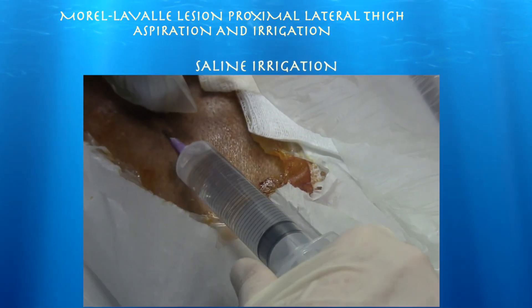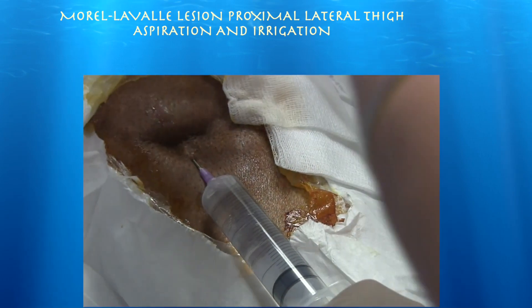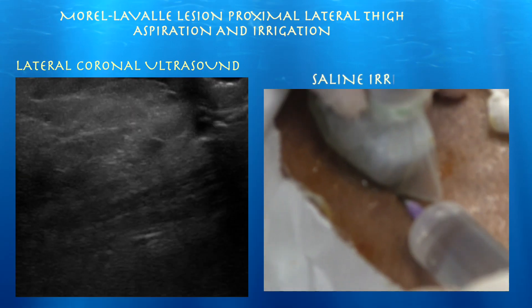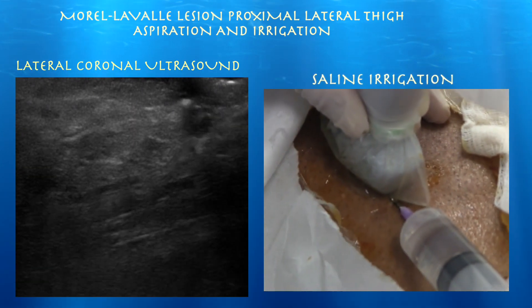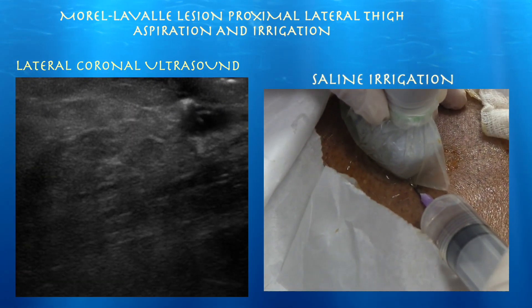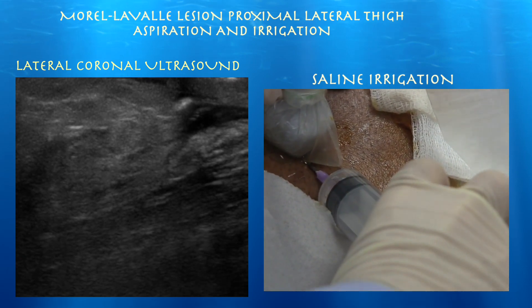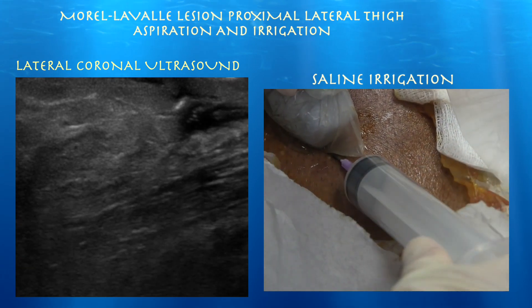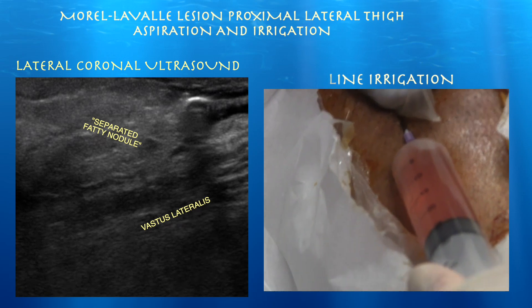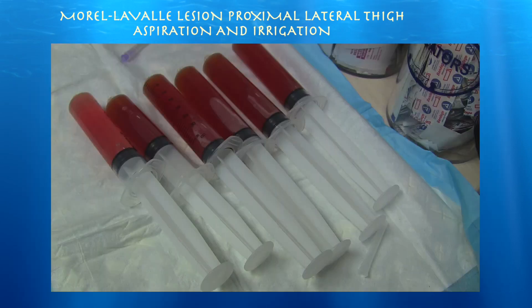We performed another aspiration and also did a little saline irrigation, which you can see us injecting. Then we tried to withdraw whatever we had injected. This is what we obtained during the second drainage.